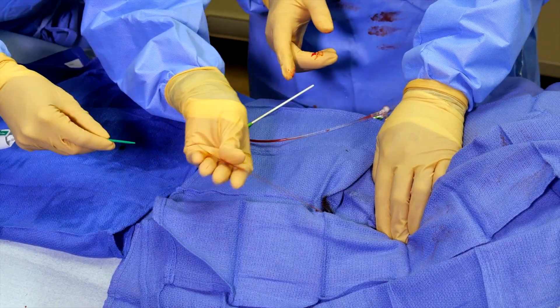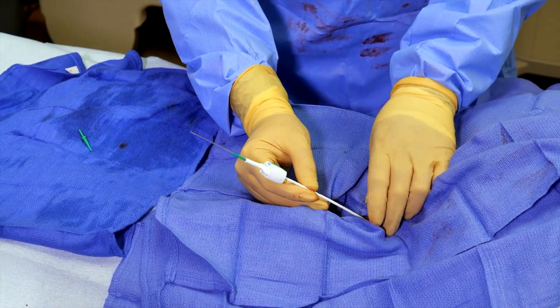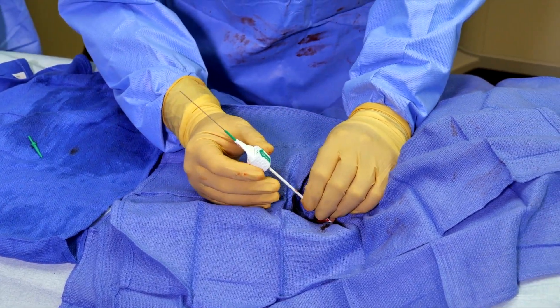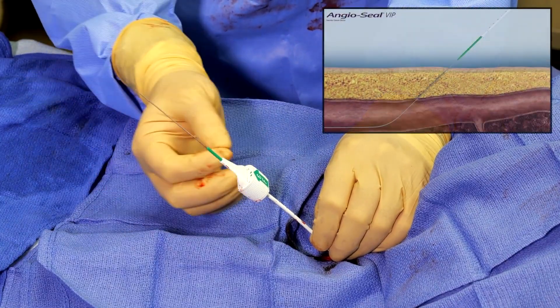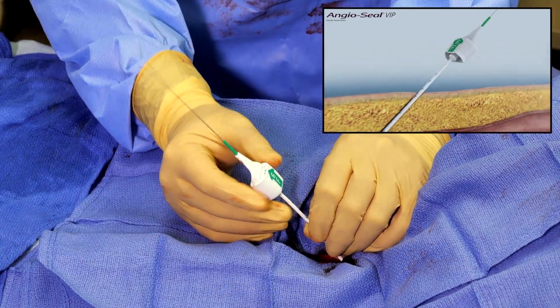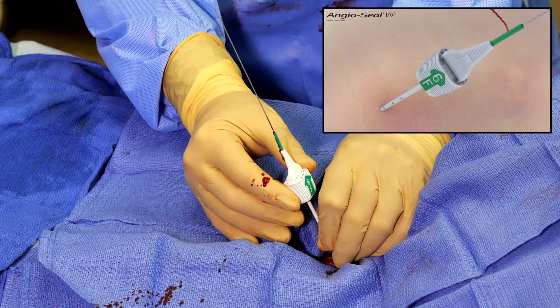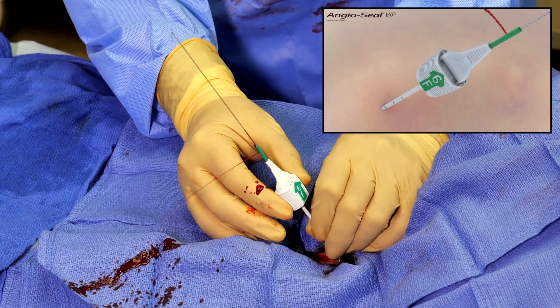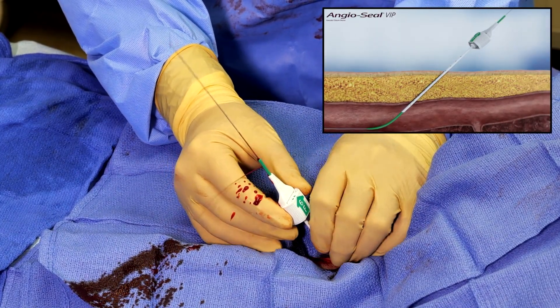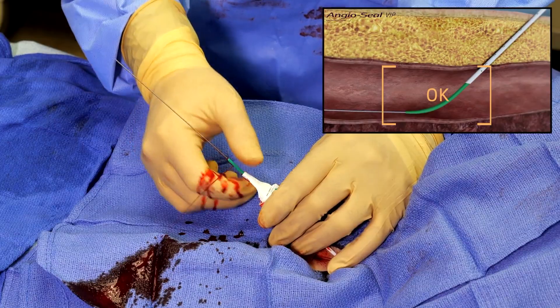We're going to put the device — the sheath and the locator, which are now together as a unit — and slide that in. Now comes probably the most important step: we advance this sheath in and look for a return of blood. It's going to be a fairly conspicuous sign that the vessel locator is in the artery. A small amount of blood is not necessarily going to define it. There it is — as I said, it's fairly conspicuous. I go in, then come back, confirming I'm in the artery. This defines the intravascular portion of where the device is.